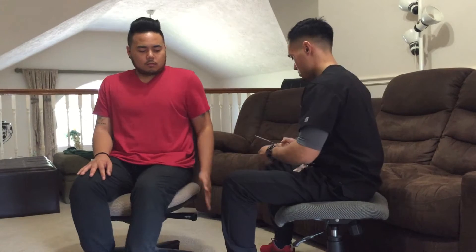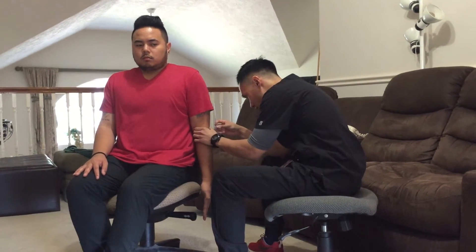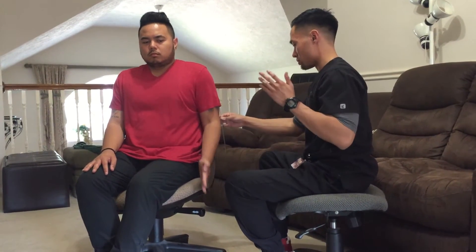So now can you please straighten your arm? Now can you bend your elbow as far as you can?